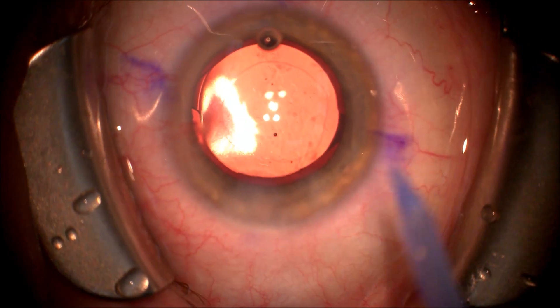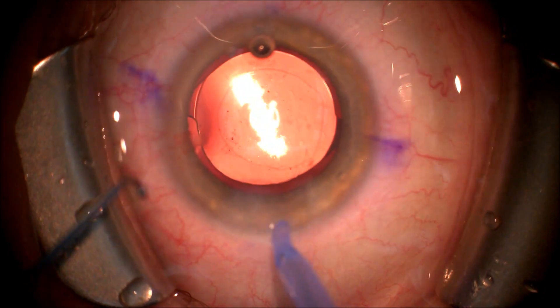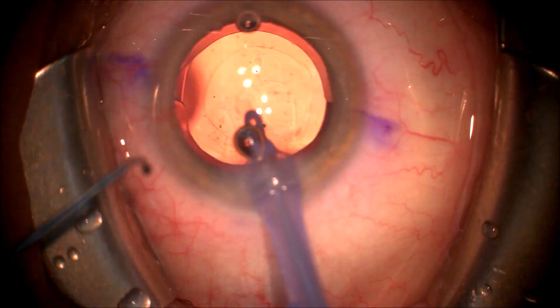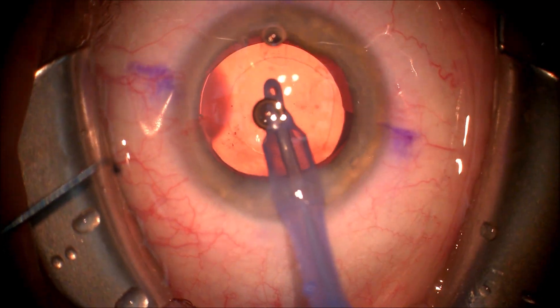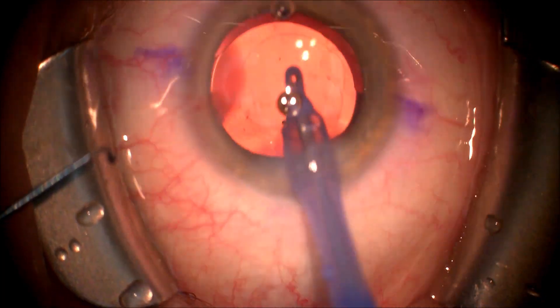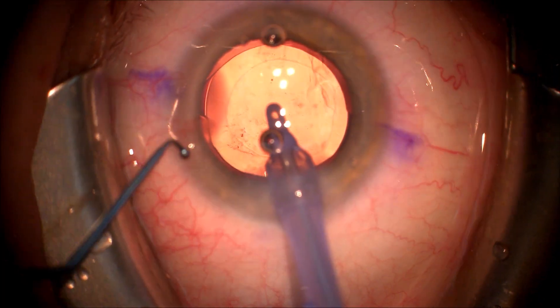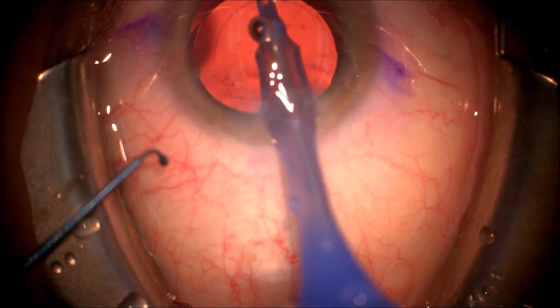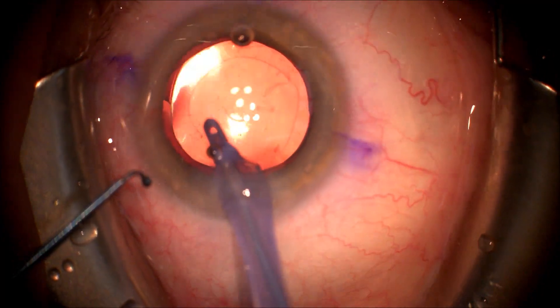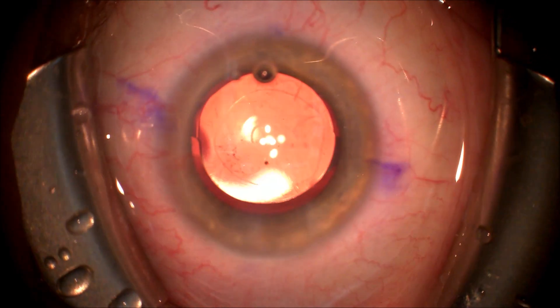The position of the intraocular lens is good. We're going to remove the viscoelastic from the anterior chamber using the automated irrigation aspiration handpiece and make sure that the viscoelastic is removed behind the intraocular lens by using a rock and roll technique.